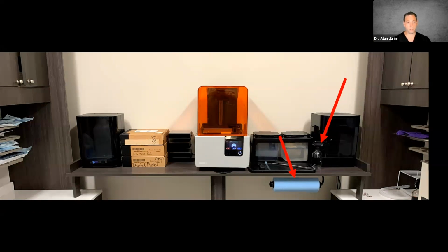The other important part that I feel has a lot of merit within 3D printing is that printers themselves are an output device. It does not mean that you have to become a master of intraoral scanning or a master of design. In fact, what we were doing in our laboratory, and what a lot of other clinicians I work with have adopted, is having the printers in their practice while their laboratory team, their design team, their remote team produces the digital tooth setup and sends it to the printer in the office directly.